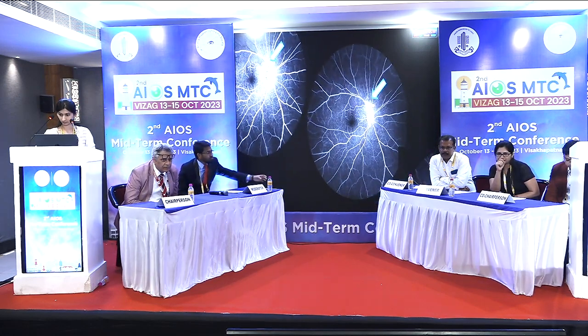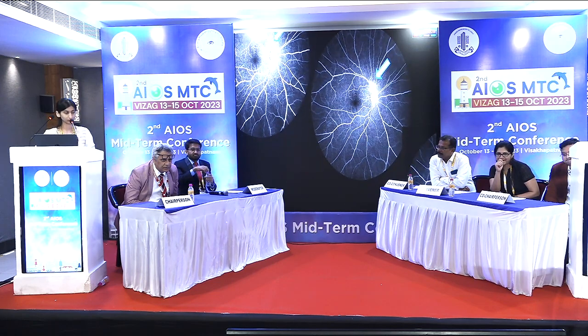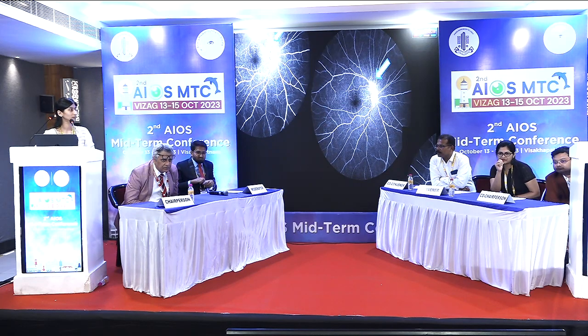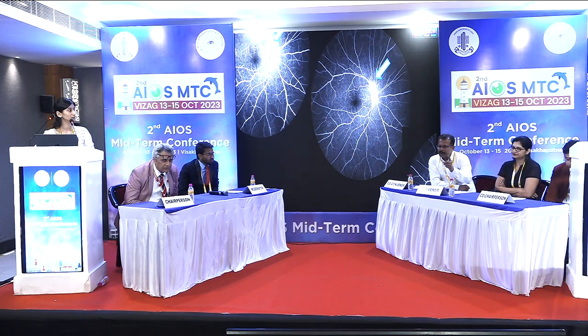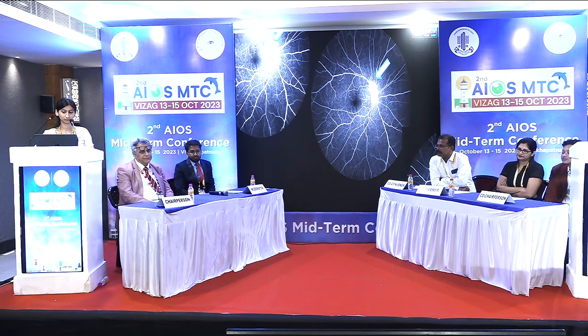Actually, see that the aneurysm is not filling up. See that? It's already thrombosed. The thrombus, or whatever is in there, is already there. So that itself might be causing a retinal artery occlusion. So branch artery occlusion, yes, sir. Very good angiogram. Very nice case.